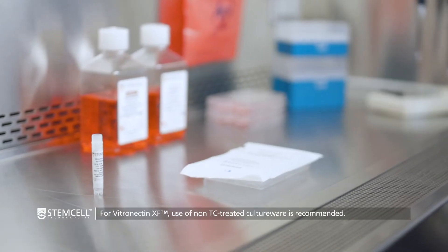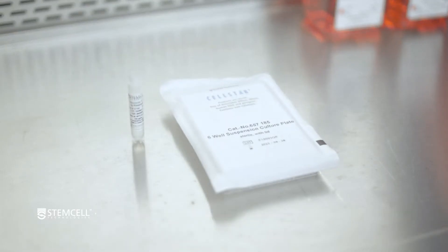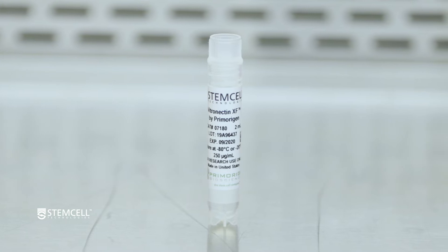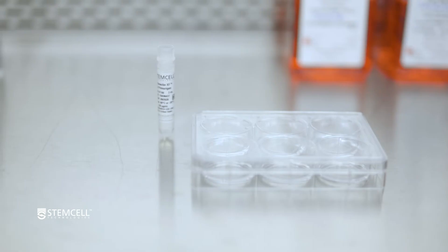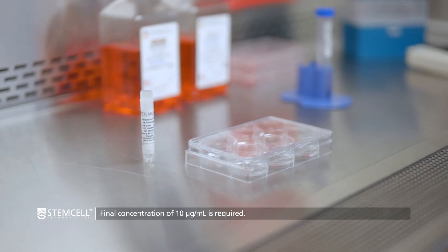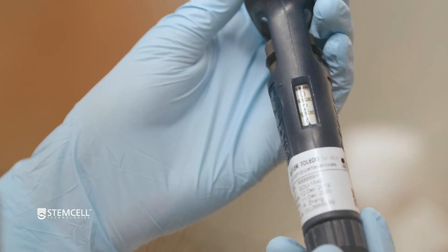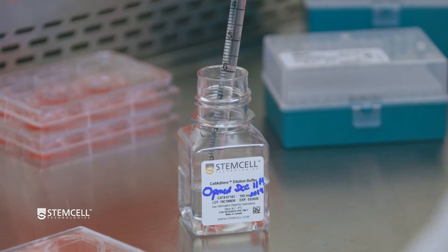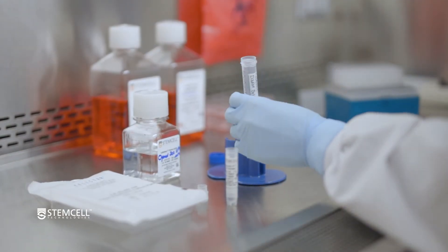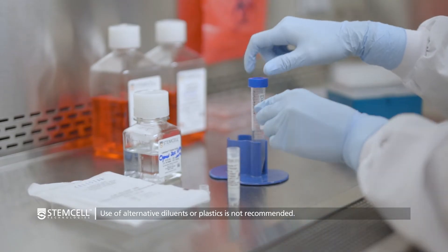For coating with Vitronectin XF, it is important to use non-tissue culture-treated cultureware to ensure optimal cell attachment. Thaw Vitronectin XF at room temperature. The stock concentration is 250 micrograms per milliliter and it must be diluted to a final concentration of 10 micrograms per milliliter for plate coating. To prepare 6 milliliters of Vitronectin XF for plate coating, add 240 microliters of the stock to 6 milliliters of cell adhere dilution buffer in a polypropylene tube and gently mix. Vortexing is not recommended. Also, the use of alternative diluents or plastics may affect cell attachment.